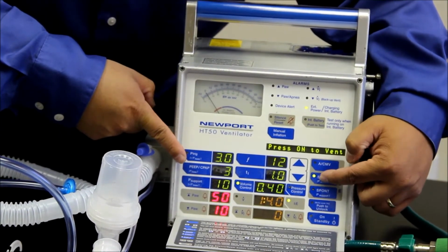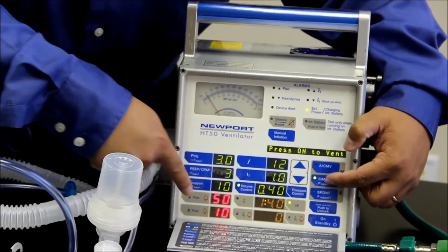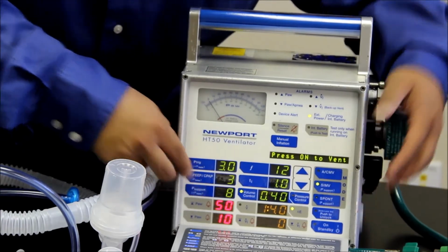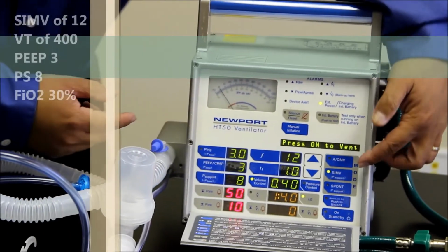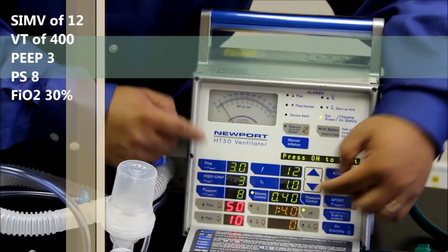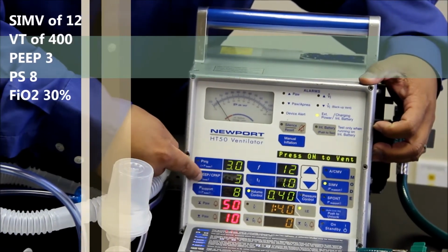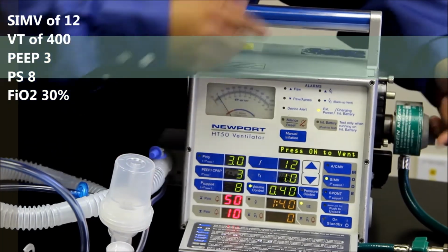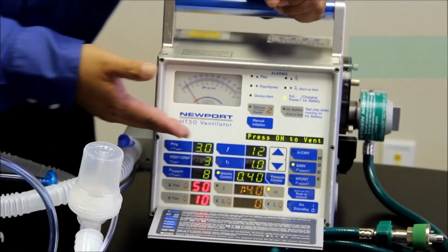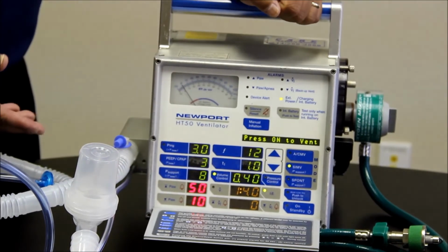And so once the patient's in SIMV control mode, we're going to go ahead and give a pressure support of, let's go with pressure support of 8. There you go. So right now we have a patient on SIMV, rate of 12, with a tidal volume of 400, PEEP of 3, and pressure support of 8, and a FiO2 of 30% back here. So that's when a patient's on SIMV mode.